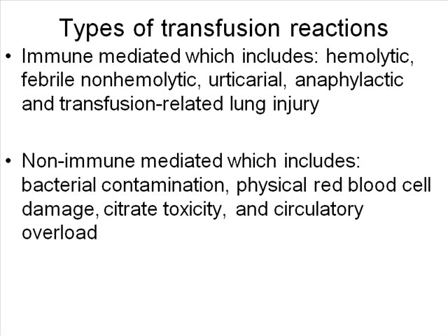In my experience in the blood bank, I have seen a lot of this, and it was mainly from not inspecting the unit clearly when you gave it out. It is important to look at the unit, make sure it doesn't look funny. Hemolyzed cells look funny. Bacterial contamination can cause hemolysis.